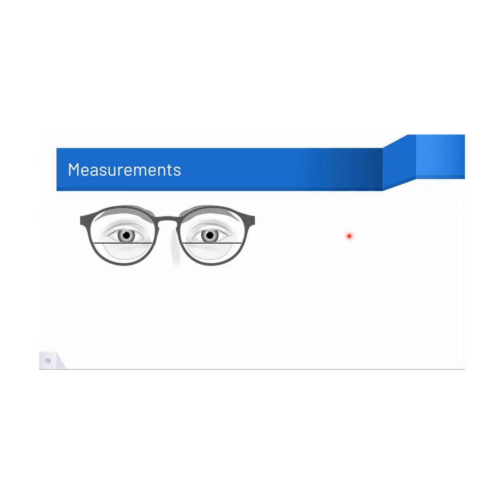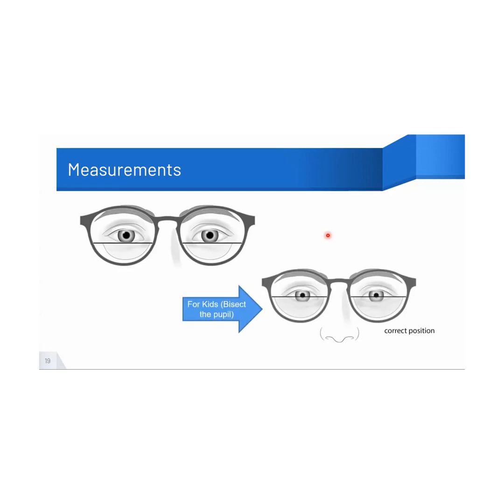Bifocals are used for various applications, and people who are into pediatric optometry know they don't see bifocal as just another design to correct presbyopia; there are many applications for which they are using it. And I got a response from Shruti as well on the call. She says yes, lower pupil margin. Basically, I did some research of my own to understand, and from the majority of the sources, and I would say a few valid sources, the recommendation is this.